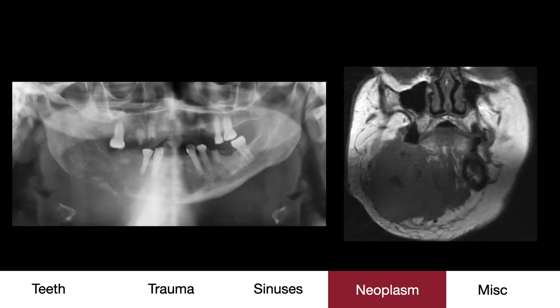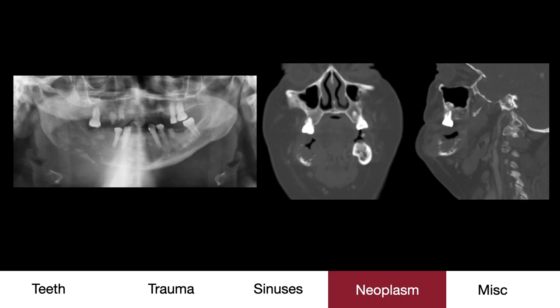Here is another more severe case on panorex with corresponding MR, and here is another. Since the alveolar nerve is damaged, the patient will typically have sensory loss in this region.